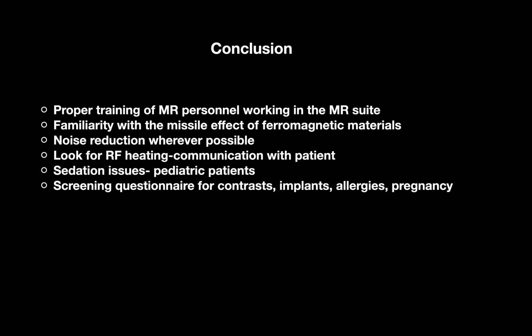Let's talk about the conclusion. In the conclusion, proper training of MR personnel working in the MR suite should be there. They should know about the hazardous effects of ferromagnetic material and should know about the emergencies in the MRI. Familiarity with the missile effect of ferromagnetic material should be there for everyone. Noise reduction whenever it is possible. Look for radio frequency heating. Communicate with the patients while scanning.